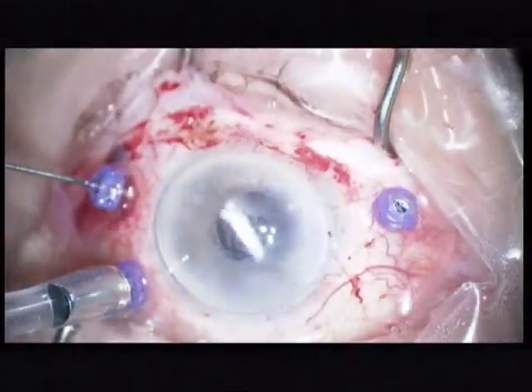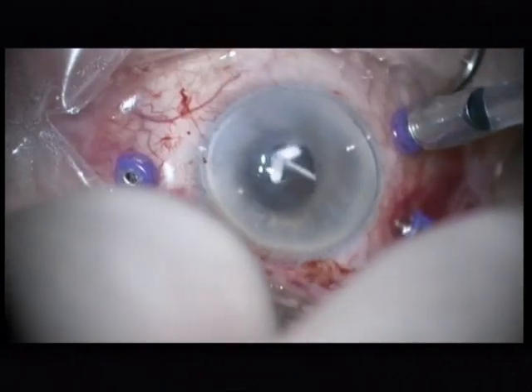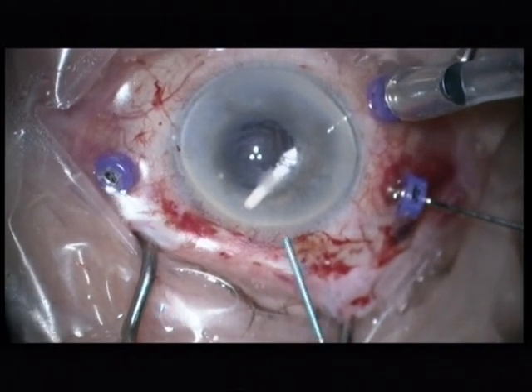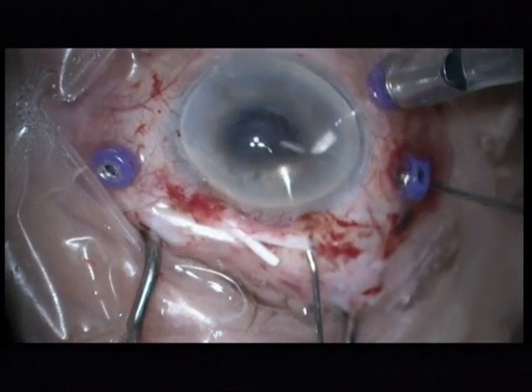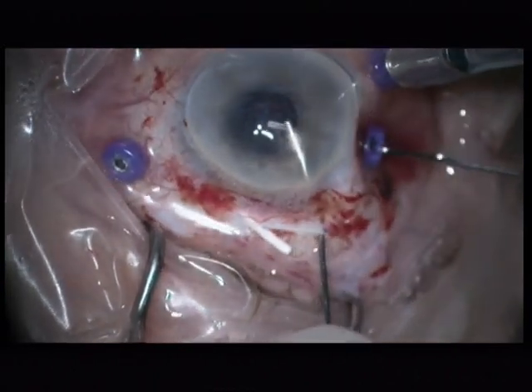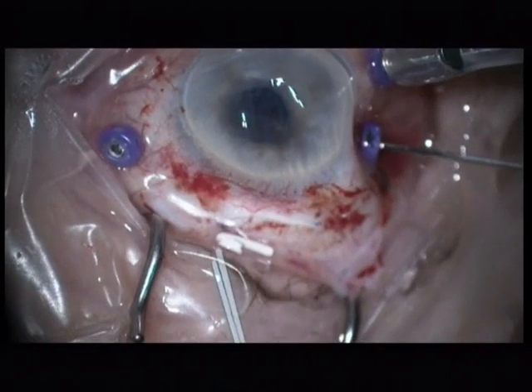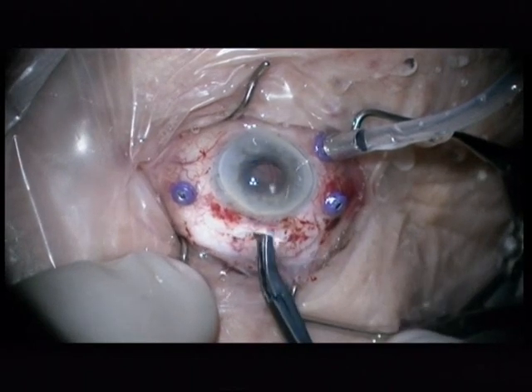Oh, I lost it. So again, new try, grab the pellet, lift it up, introduce it into the anterior chamber. You see it's breaking into parts again. Again, viscoexpression maneuver with BSS cannula. One part is out, and I'm lucky, also the other part can be removed. You see both parts leaving the scleral tunnel. Okay, now you see there is nothing left on the posterior pole.